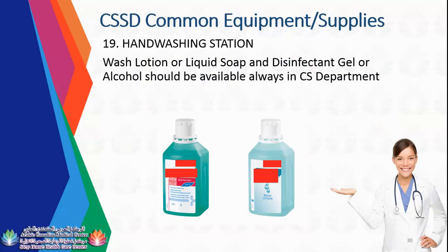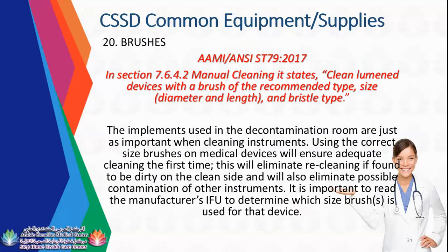Hand washing station is very important in CSSD because of some infection control protocols. So it is one of your supplies. There should be a disinfectant solution and then a wash solution. Brushes are one of your supplies and equipment in CSSD. As per the new updates on manual cleaning, it states: clean lumen devices with a brush of recommended type, size, diameter, length, and bristle type.